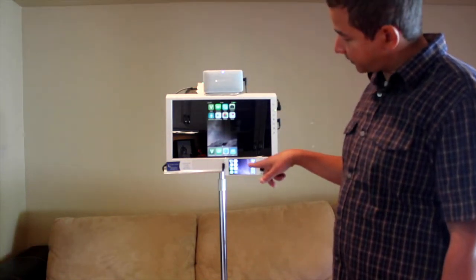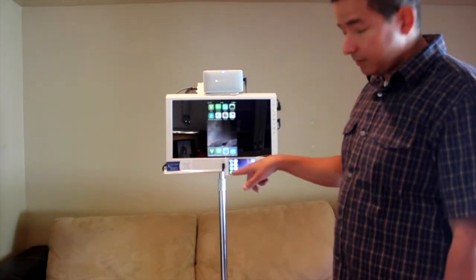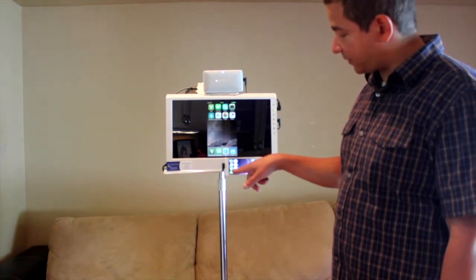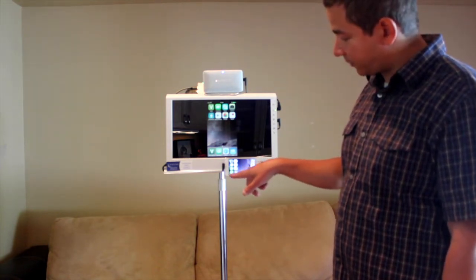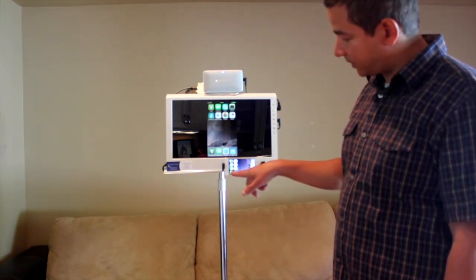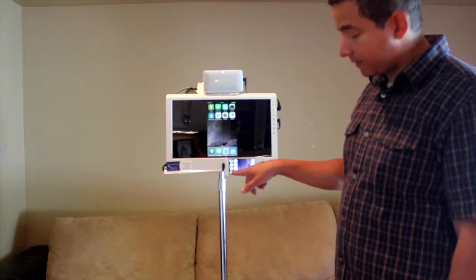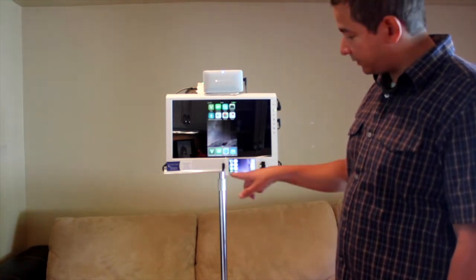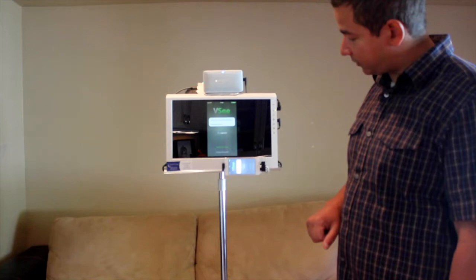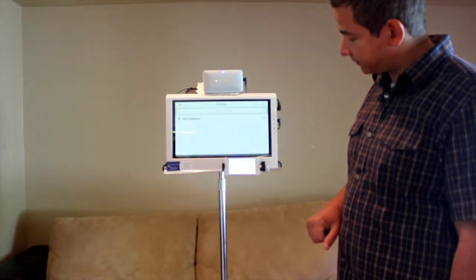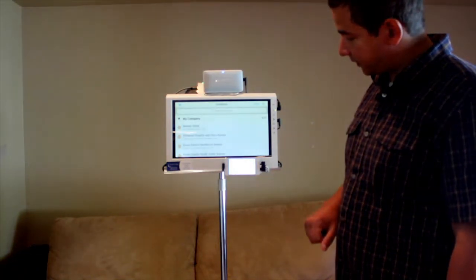At this point, locate your VC video conferencing icon, which in the landscape orientation will be on the bottom left of the screen. You tap that and that will open your address book.